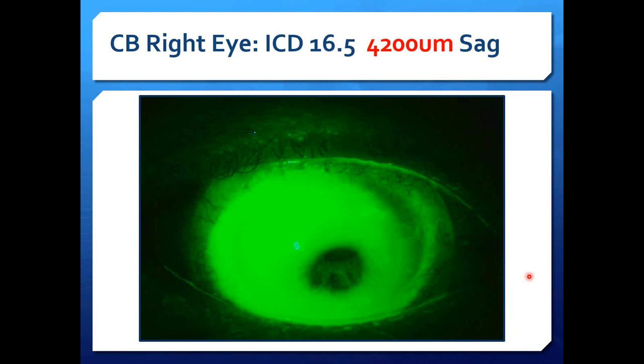So by not having adequate depth, we haven't cleared corneal tissue, but oddly enough, this patient is very comfortable. Now, how is it possible that we could have this heavy bearing on the cone and yet the patient is comfortable? It simply comes down to movement. There's enough shared bearing of landing out here that this lens would actually center and would actually be comfortable. But would it be healthy? Of course not. This would be a very poor scleral lens fit.